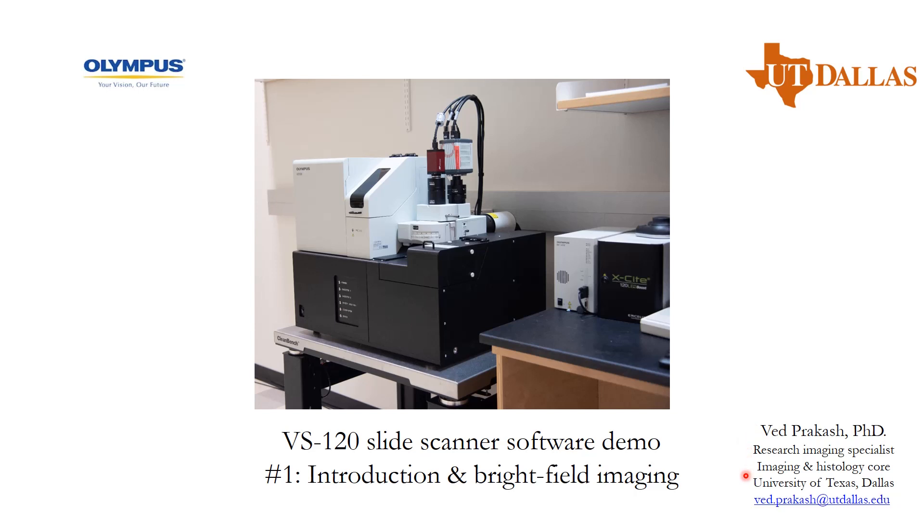Today, we'll be discussing how to use the virtual slide scanner microscope software. In the first module, we'll be learning how to do bright field imaging. In module number two, you'll be learning how to do fluorescence imaging.